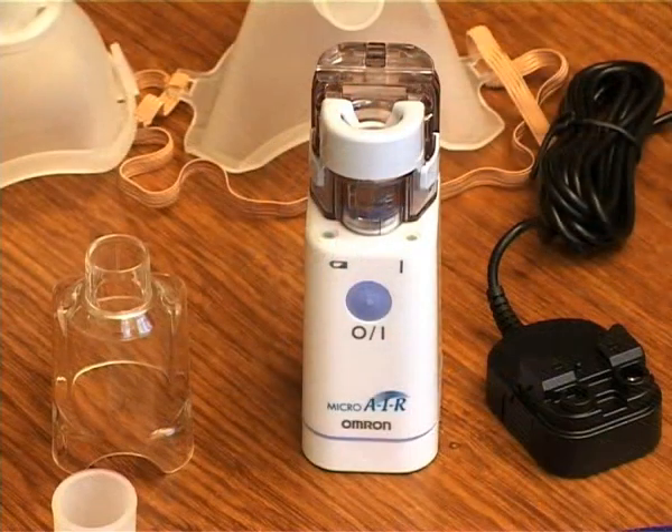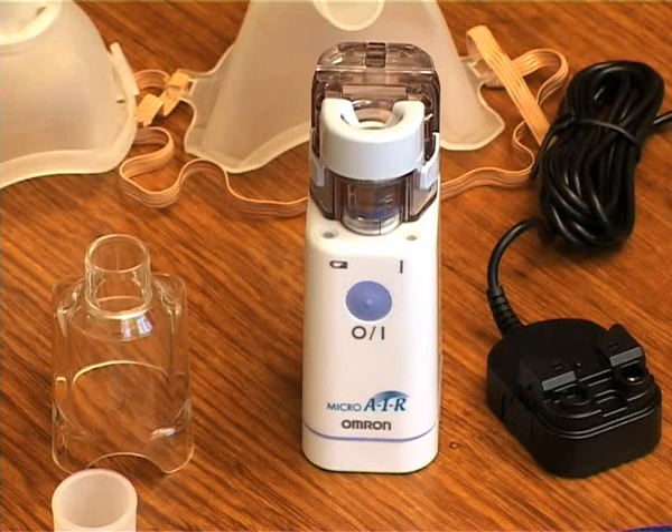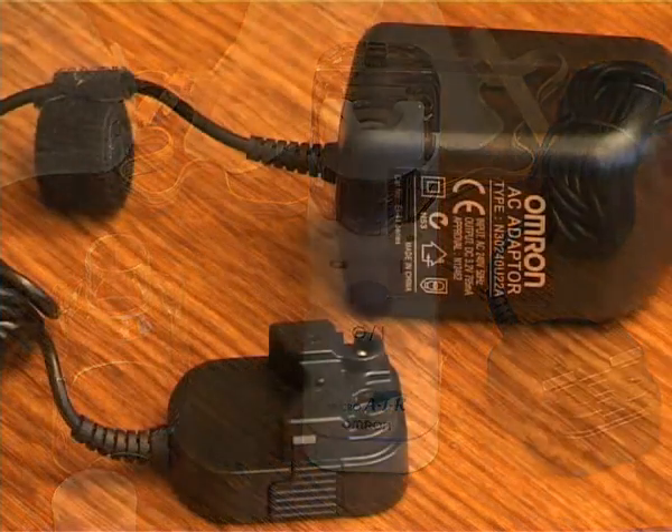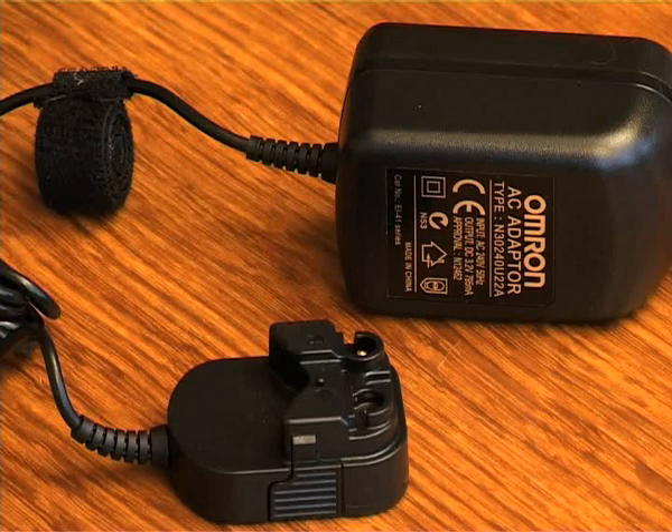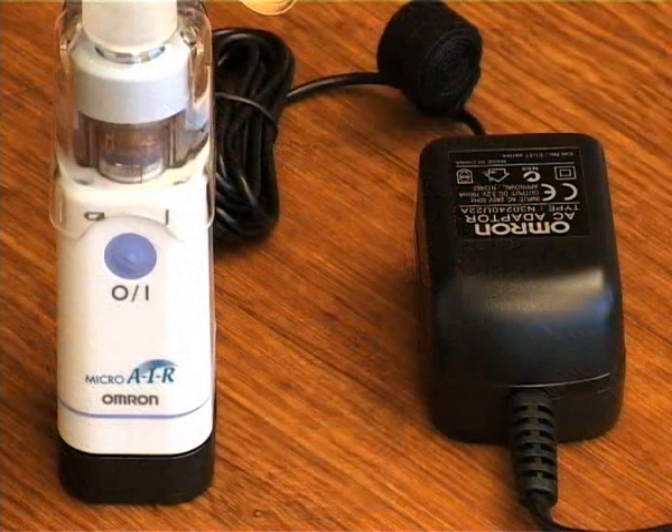When the low battery indicator turns orange, it is time to replace the batteries. When used on batteries, the unit can be powered for approximately eight days if the unit is used for 30 minutes per day. Please note that the AC charger does not act as a battery recharger if you are using rechargeable batteries. The nebuliser does not draw on the batteries when the AC charger is used.